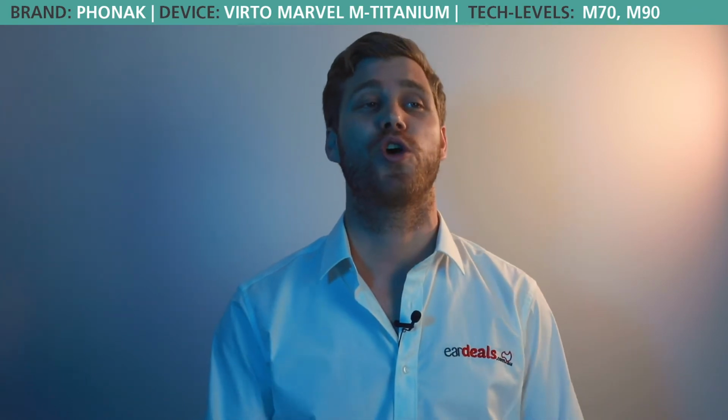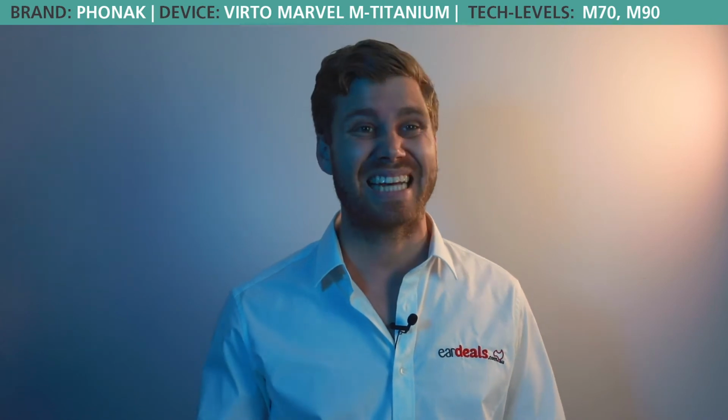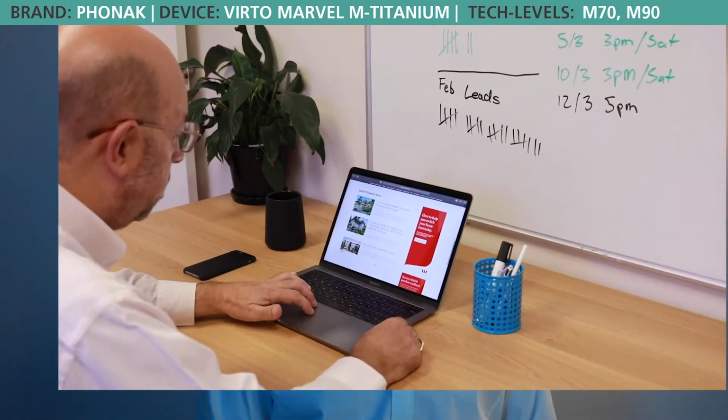For instance, the hearing aid automatically adjusts into the correct program for the noisy environment that you have physically entered or you've been subjected to. My favourite real-world example is one of a real estate agent, as most people in Australia understand the style of work and what they do day to day. So in the context of explaining the technology, please put your real estate agent hat on.